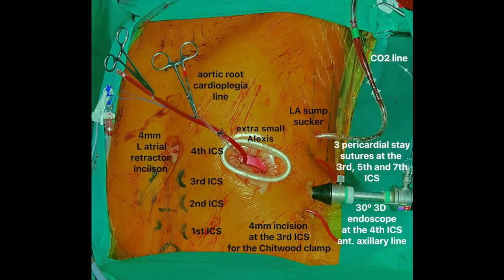We use a separate 4 mm incision at the 3rd intercostal space right anterior axillary line for the Chitwood clamp, the 7th intercostal space for the left atrial sump sucker, again in the right anterior axillary line, and also at the 4th intercostal space right parasternally for the left atrial retractor.